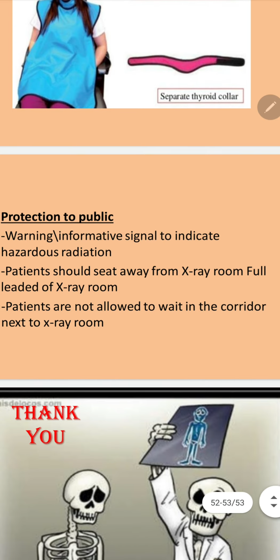Protection of the public. Warning, informative signs to indicate the hazardous radiation. Patients should sit away from the X-ray room, which should be fully leaded. Patients are not allowed to wait in the corridor next to the X-ray room.